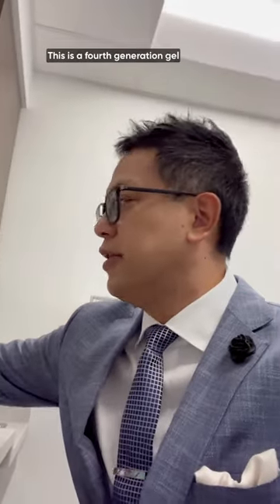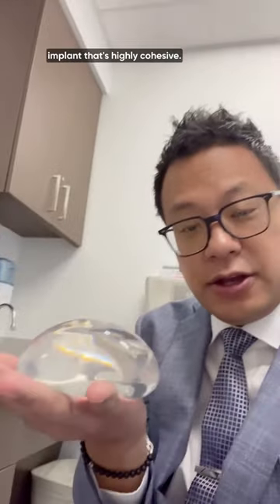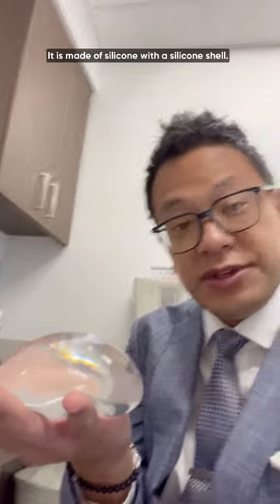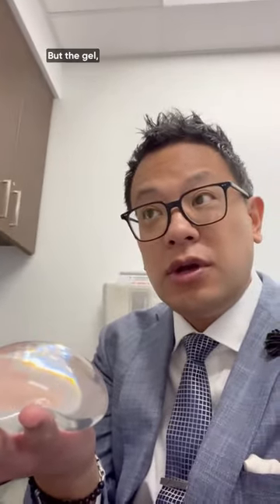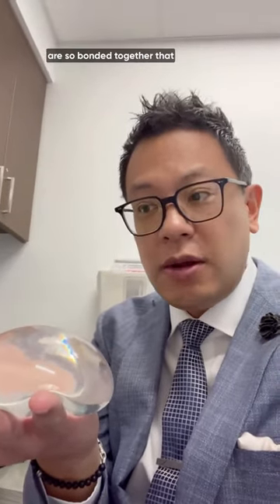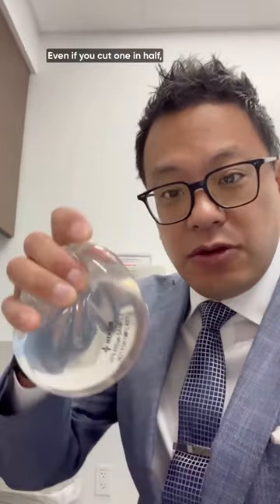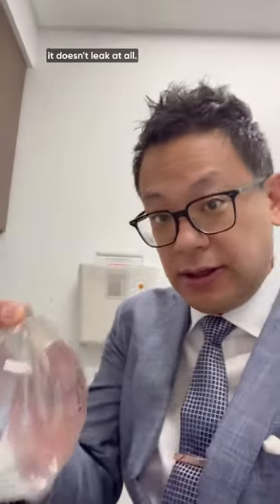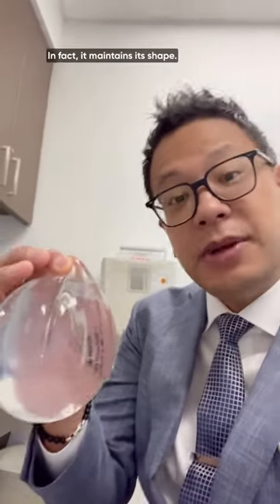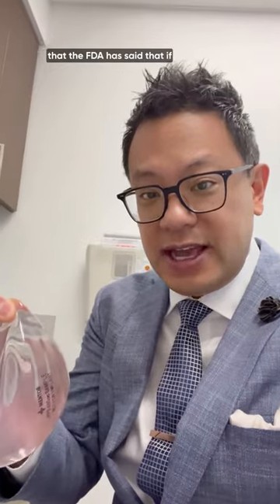Let's take a look at these implants here. This is a fourth-generation gel implant that's highly cohesive. It is made of silicone with a silicone shell, but the cohesive molecules of the silicone are so bonded together that it is jello on the inside, and even if you cut one in half, it doesn't leak at all. In fact, it maintains its shape.